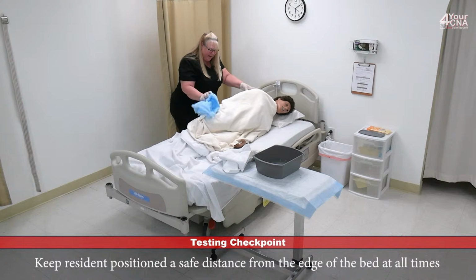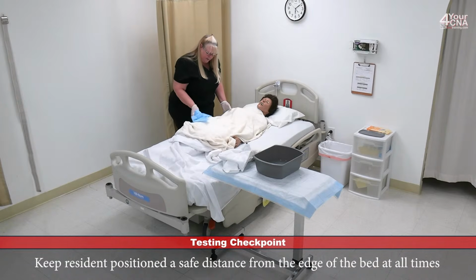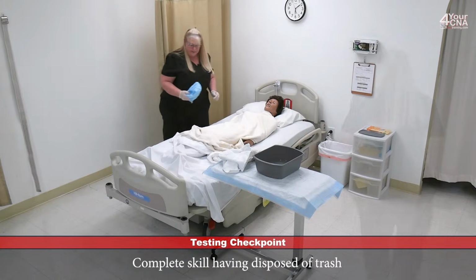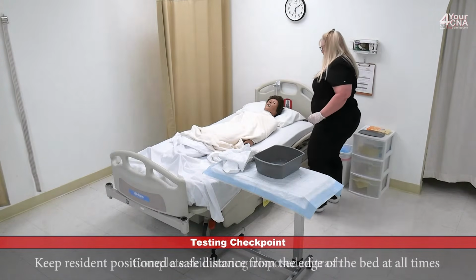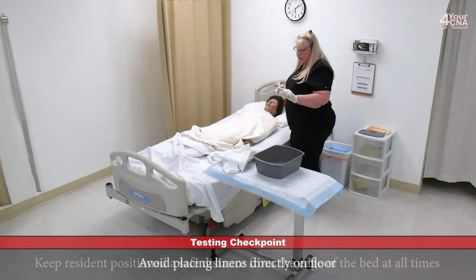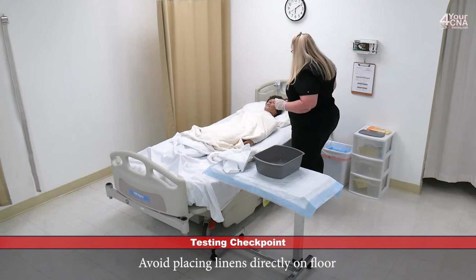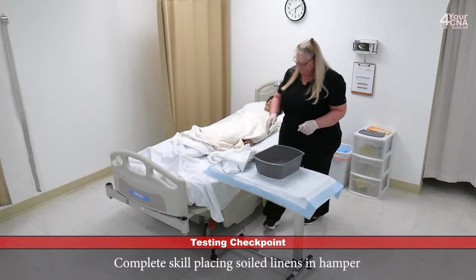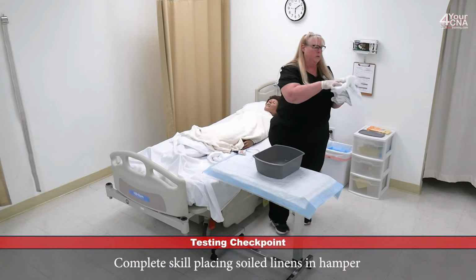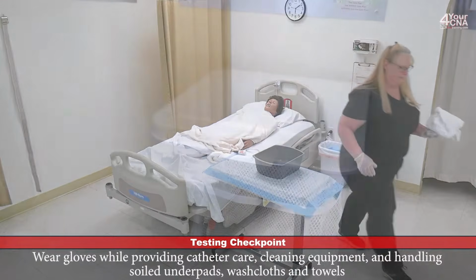Come on back onto your back. And then if you can scoot to the middle. Thank you. I'm going to go dispose of this. Okay, Mrs. Jones, you're covered. You're safely in the middle of the bed. I'm going to go dispose of your linens and clean your basin. I'll be right back. These items will go in dirty linen.